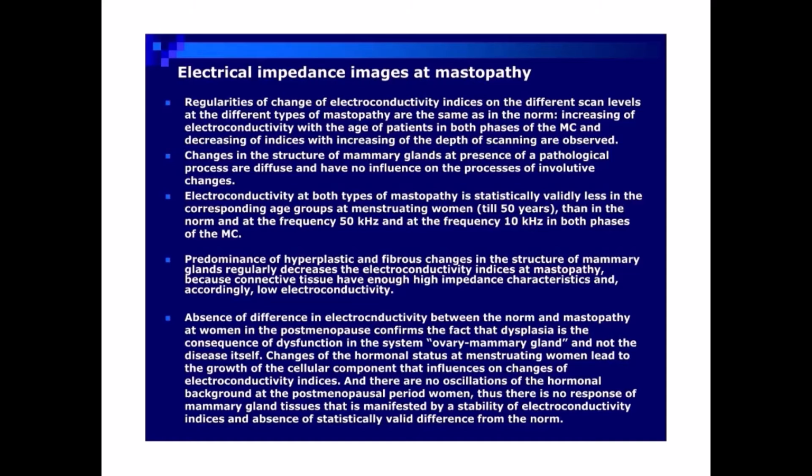Changes of the hormonal status at menstruating women lead to the growth of the cellular component that influences on changes of electroconductivity indices.